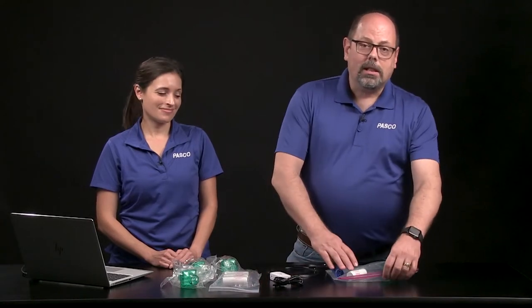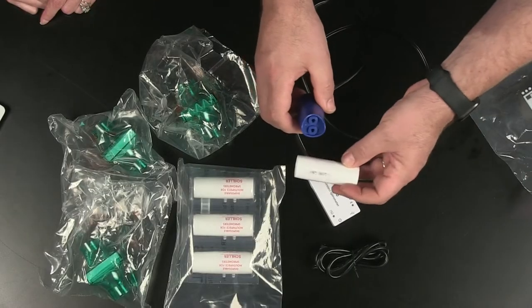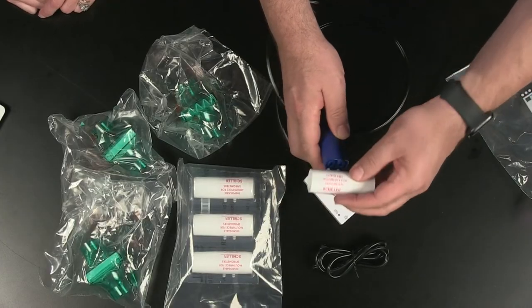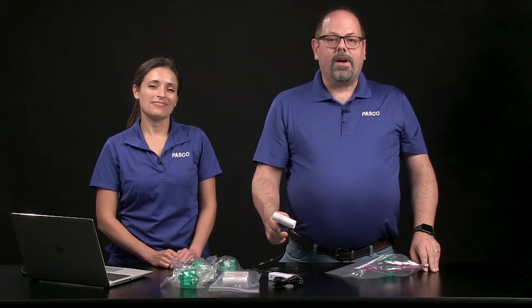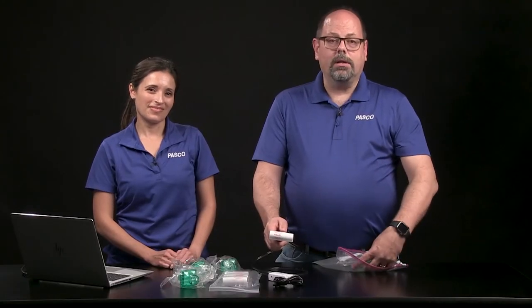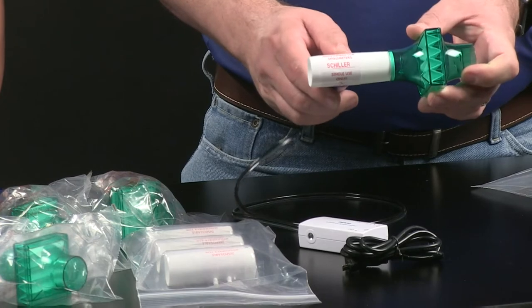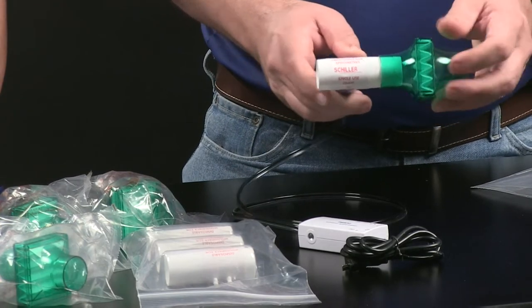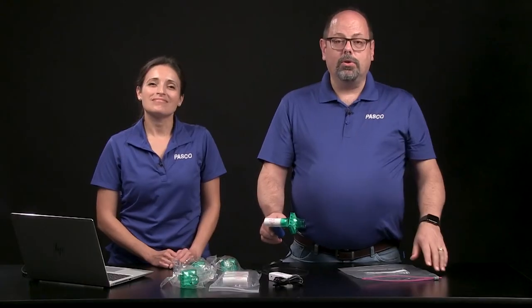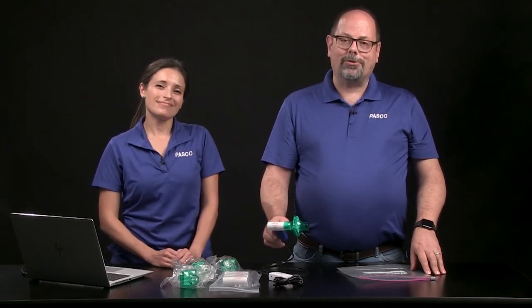To assemble the spirometer, line up the prongs on the key in the mouthpiece with the holes in the spirometer. Find the tapered end of the mouthpiece and slide the filter onto it. If the filter does not seem secure, try fitting the opposite side. The mouthpiece and filter are disposable and are meant for use with only one individual over a day or two of testing. Replacement mouthpieces and filters can be ordered from PASCO.com.